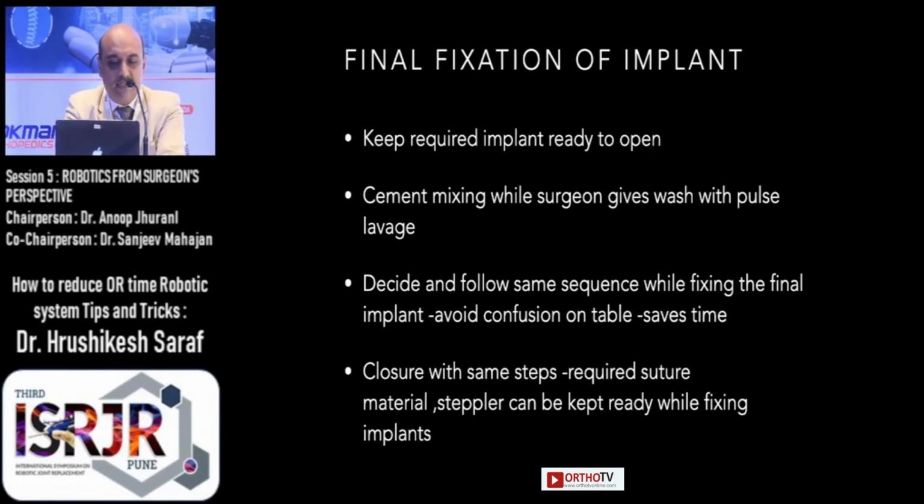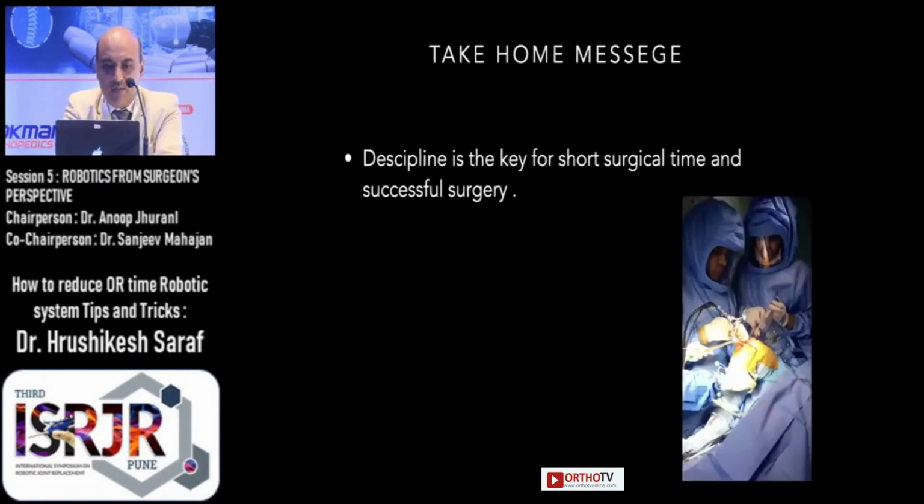Closure with the same steps, required suture material, stapler can be kept ready while fixing the implant. So what is the take home message? You can save time, definitely you can save time, and discipline is the key for short surgical time and successful surgery.